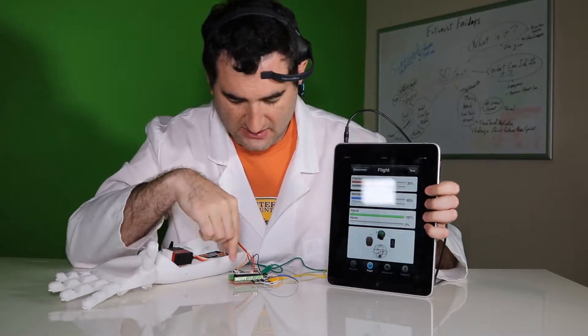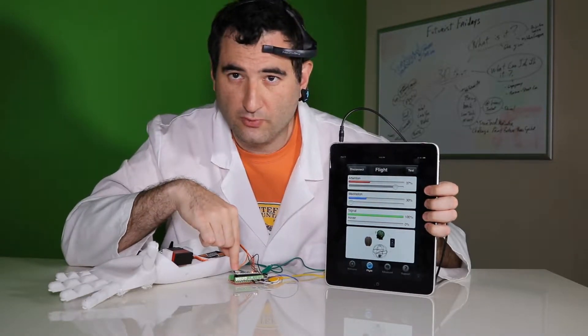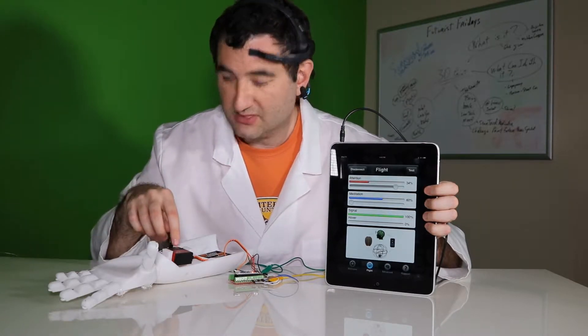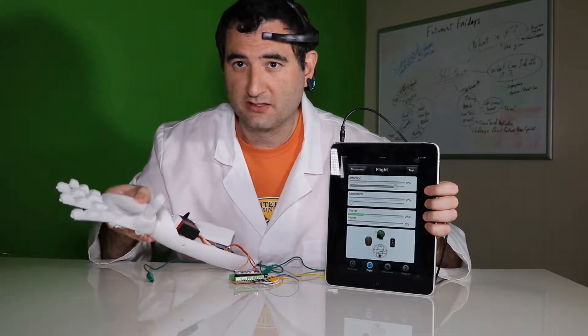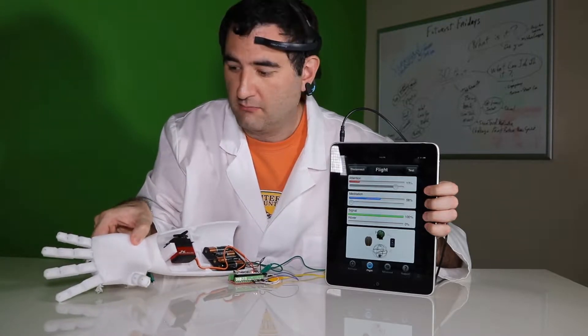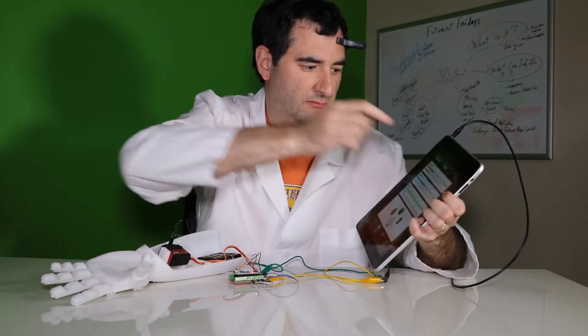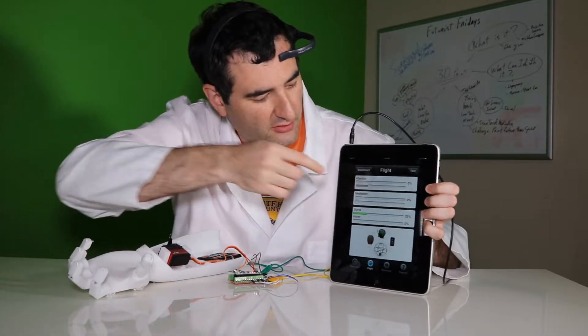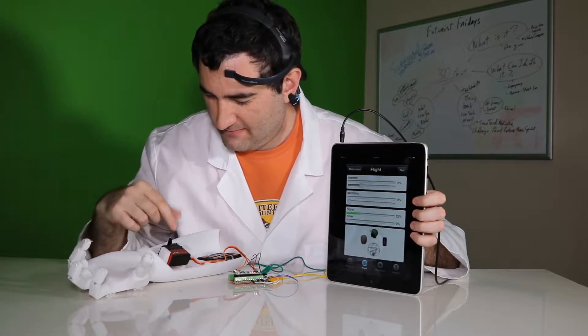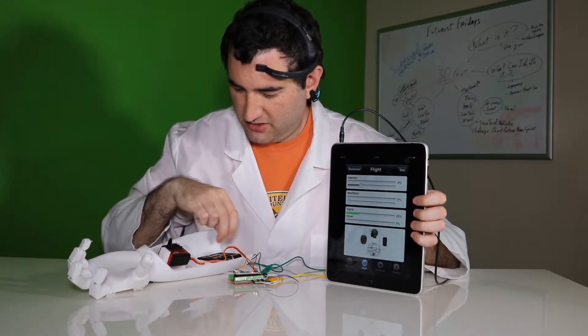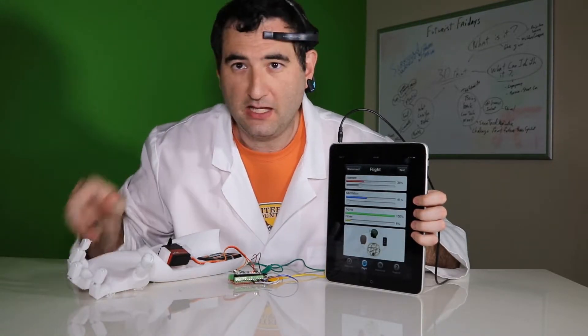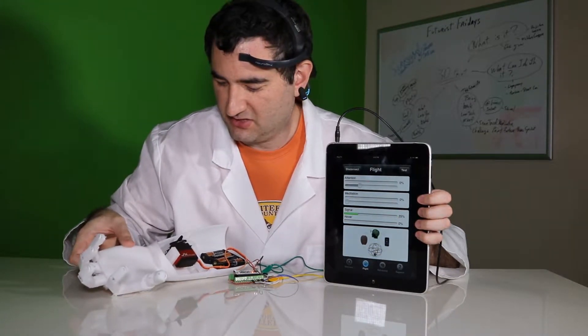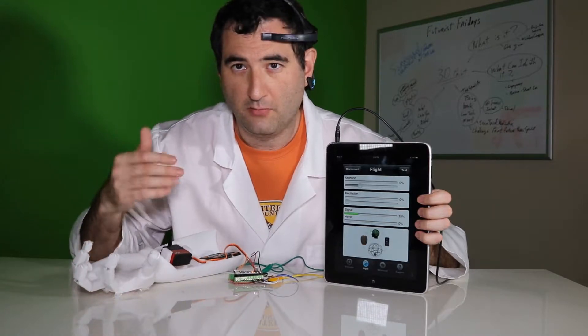This is sending a signal to this Arduino Nano. The Arduino Nano is going to send a signal to the servo that's in the wrist of the hand. Once I set a limit, there it goes. So as soon as I concentrate enough, I hit my limits, the hand will close.